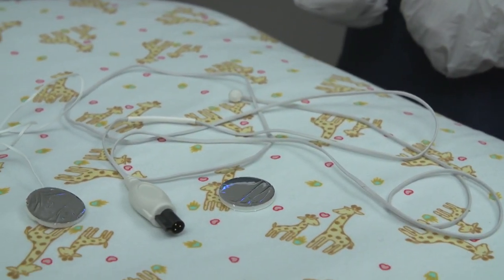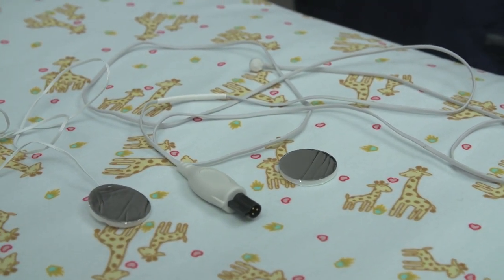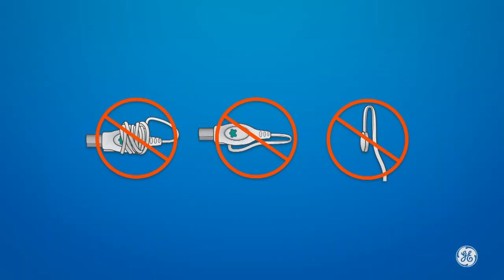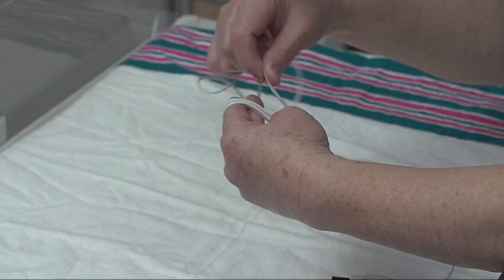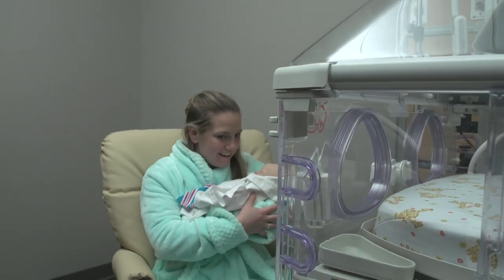Take care not to pull on the probe wire when storing the reusable probe. Do not stress the connection between the cord and the plug or tip. Do not tightly wind the probe cord or sharply bend the cord at either the tip or the plug end. This is how to store the reusable temperature probe.